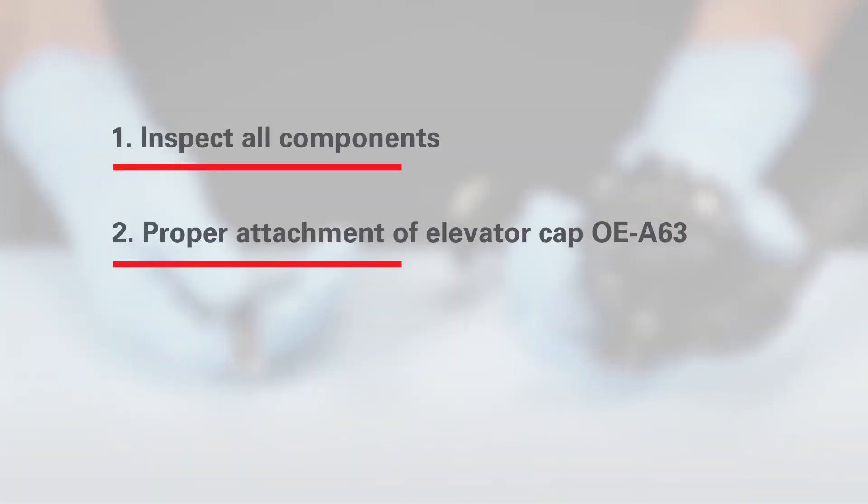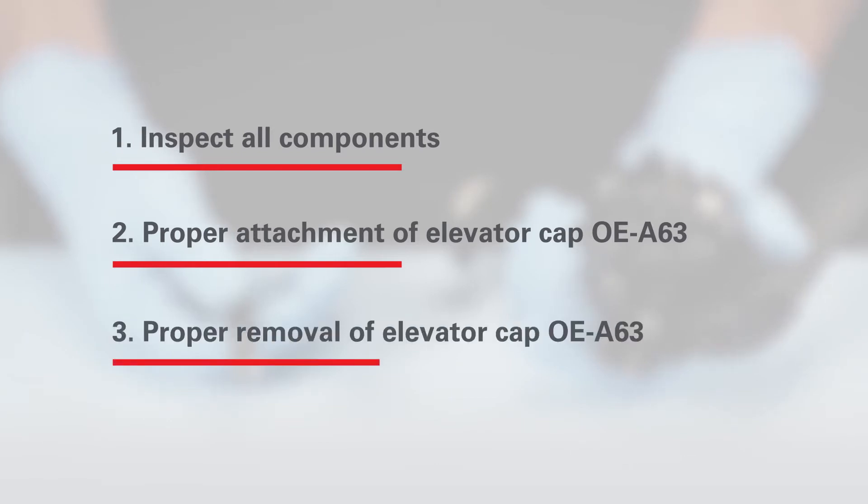We will begin by inspecting all components, then review both proper attachment and proper removal of elevator cap OE-A63.